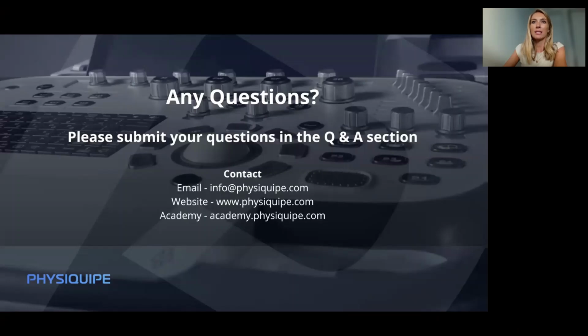Great. Okay, so rattling through some of these. How can ultrasound distinguish between active inflammatory process and chronic degenerative changes? I think you mentioned a little bit about this, didn't you? Yeah. So essentially, I think it's coupling your ultrasound with the clinical history and actually taking the patient pretty holistically. But if we were to just focus on the ultrasound itself, ultimately neovascularity on power Doppler can be a really helpful sign, and fluid, particularly in tenosynovitis, fluid either within the tendon sheath or in those inflammatory arthropathies, so fluid coming out of the joint space itself. So those are kind of the main factors I would look out for. But in the history, again, your classic inflammatory symptoms. So pain, particularly at night, morning stiffness lasting over an hour, good response to anti-inflammatories, those things in the history is kind of key, really, no matter what the ultrasound says. Yeah, so piecing it all together really is a bigger picture.